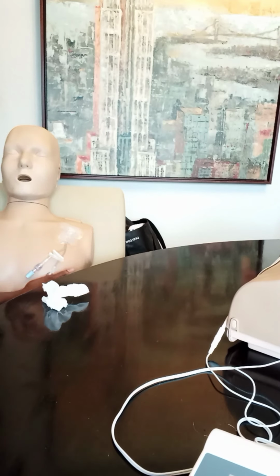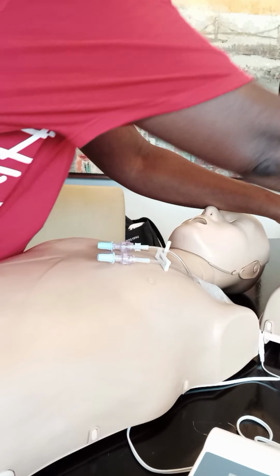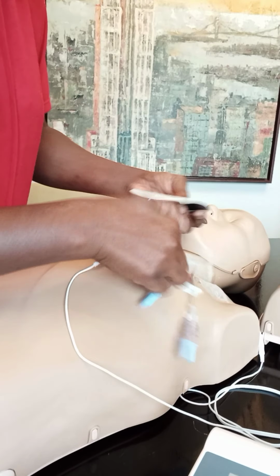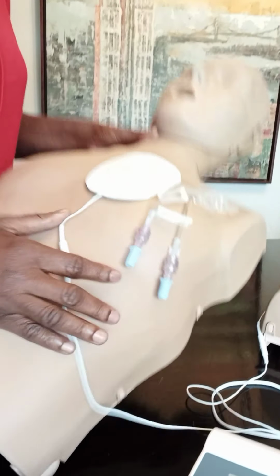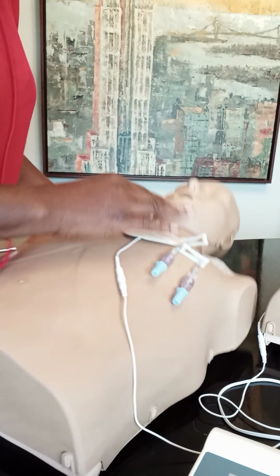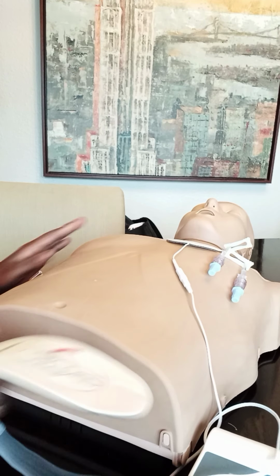So it's the same thing for an individual with the dialysis port. All you would do is you would place this right here on the chest, making sure that it sticks totally and completely. You're not putting it over that dialysis port, right? And then you're putting the left lower one on the side here, on the left part.